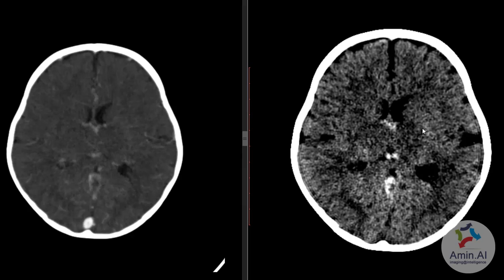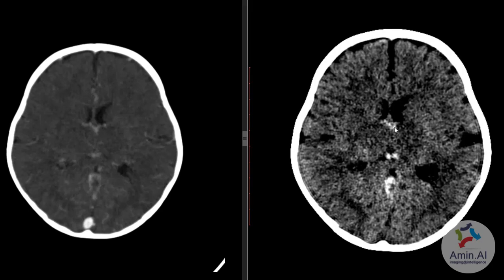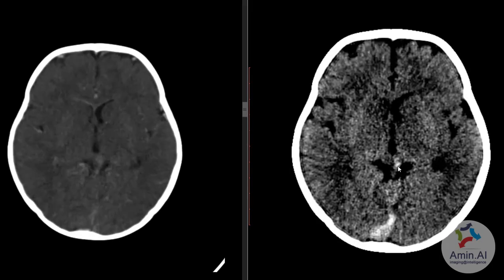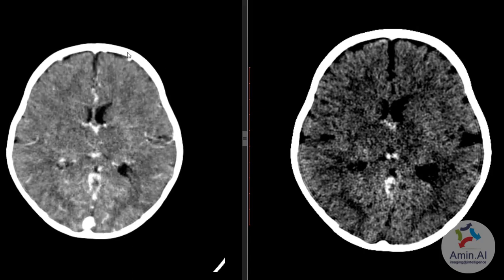Secondly, there are diffuse hyperdensities and edema in the thalamus and adjoining areas, which is due to thrombosis of the internal cerebral veins and all these venous channels. Sometimes post-contrast images are not sufficient, and in this case MR venography is advised.